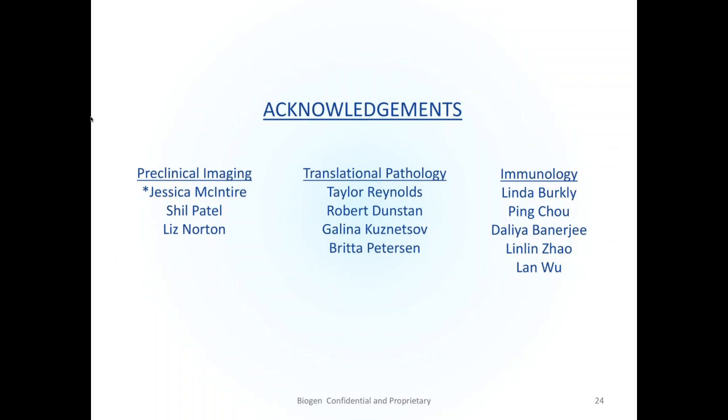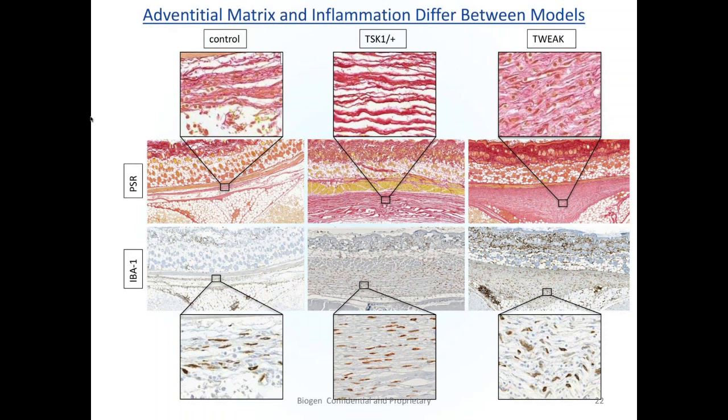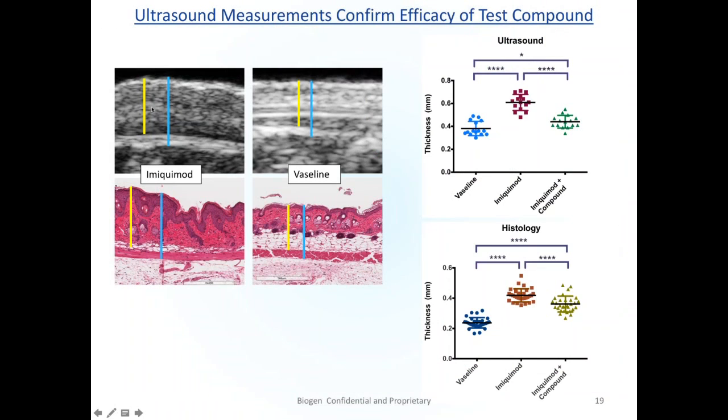With such small structures, maybe give us a sense of the distances you're measuring here. So the thickness of those layers is around... I'm going to go back to this slide. In this case, this is a caliper measurement of the normal dermal layer, it's 0.4 millimeters. And then the dark band, the hypoechoic region that we were measuring, was a little bit thicker, so again, it's sort of 0.6 millimeters, something in that region.